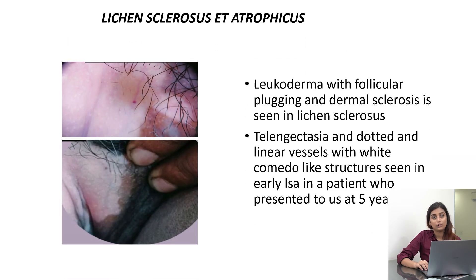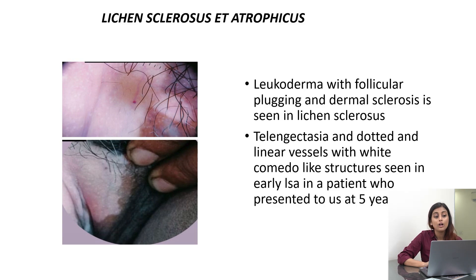There is another disorder called lichen sclerosis et atrophicus, where we have hypopigmentation in the vulval area. If you see under a dermoscope, the feature that differentiates it is that you do not get diffuse ivory white hypopigmentation. You have a background of erythema, vessels, and telangiectasia. There are dotted or linear vessels and you can see some white comedo-like structures — that is indicative of lichen sclerosis et atrophicus.